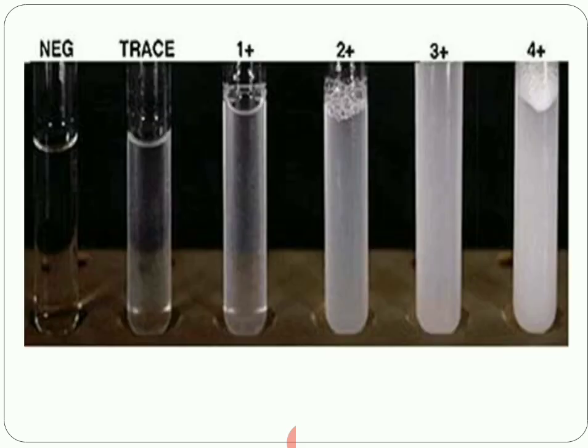Here we can see in the figure negative, trace amount of protein, then 1 plus, 2 plus, 3 plus, and the last one, 4 plus, contains a thick amount of precipitate.